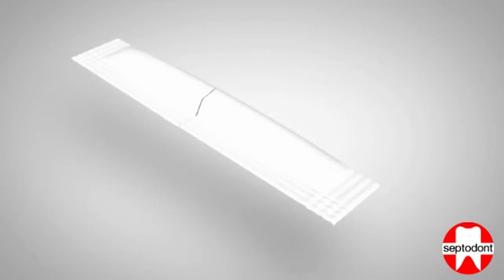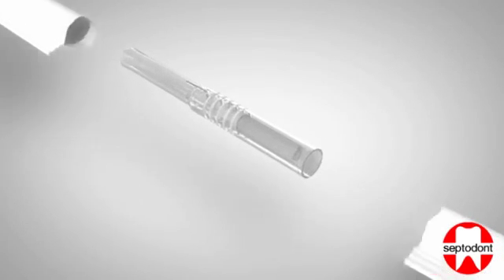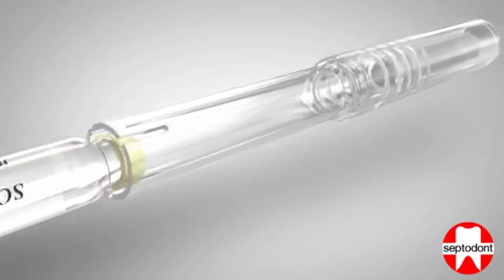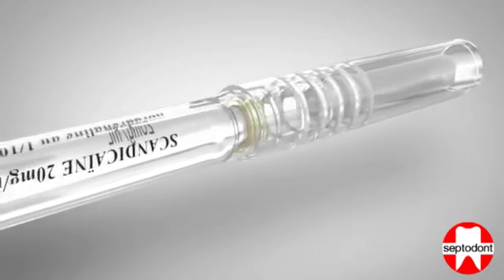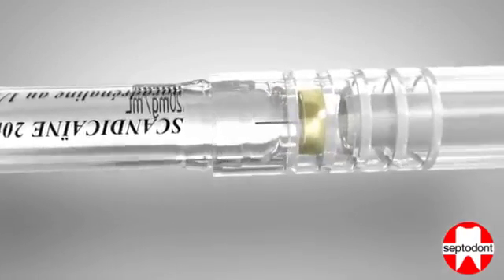Remove the syringe by tearing its protective wrapping. Step 1. Grip the barrel firmly and fully insert the cartridge into the open barrel end of the syringe.